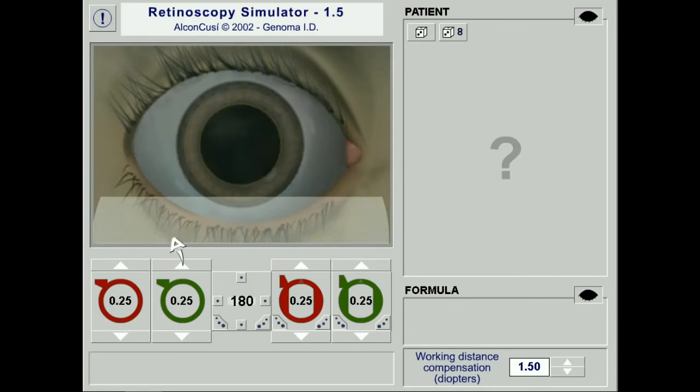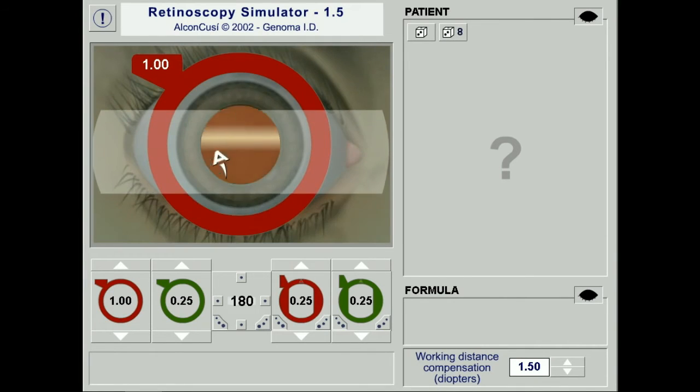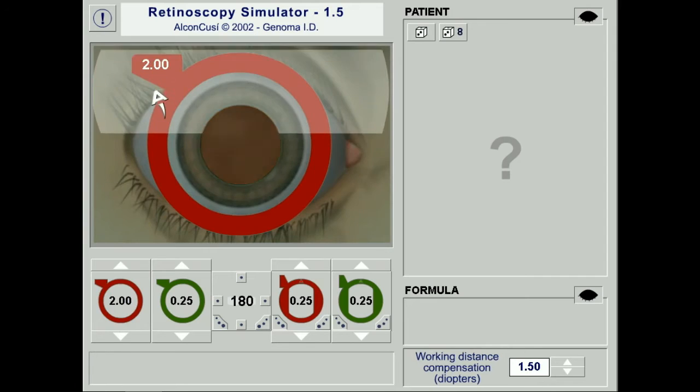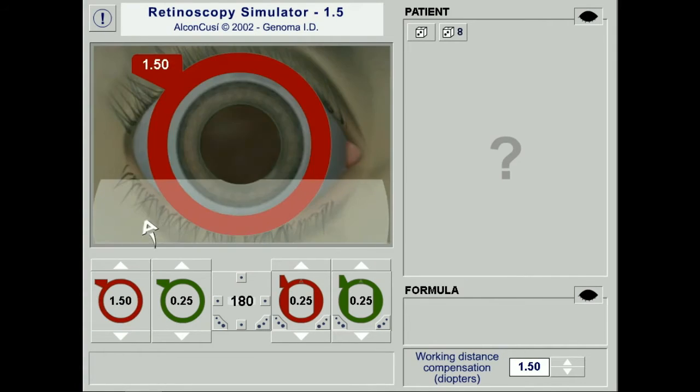Now I'm checking on the horizontal axis. I observe an against movement. As I put in the 1 diopter sphere lens, I observe an against movement. As I increase to a 2 diopter sphere lens, I observe a with movement. Now at 1.50 diopter sphere lens, I observe an against movement. Finally, at 1.75 diopter sphere lens, the reflex is neutralized.